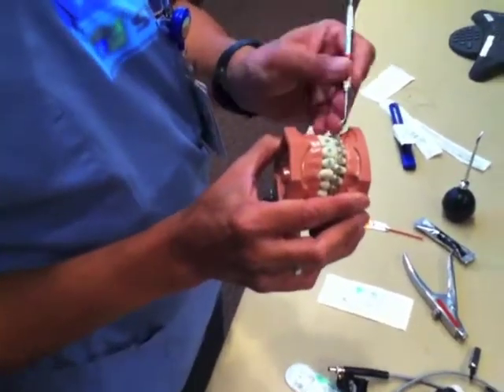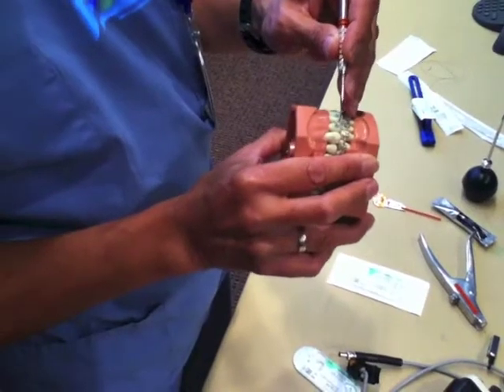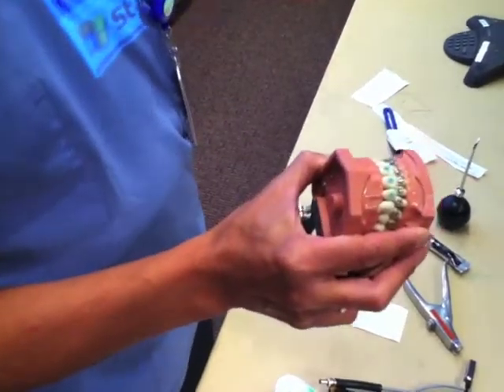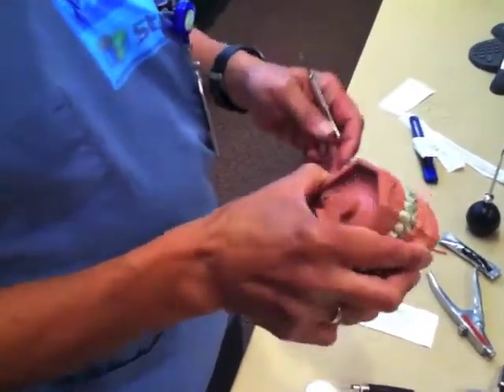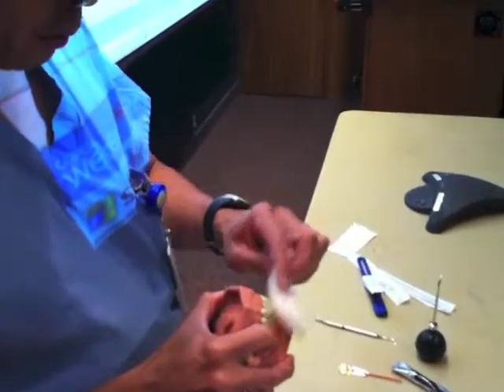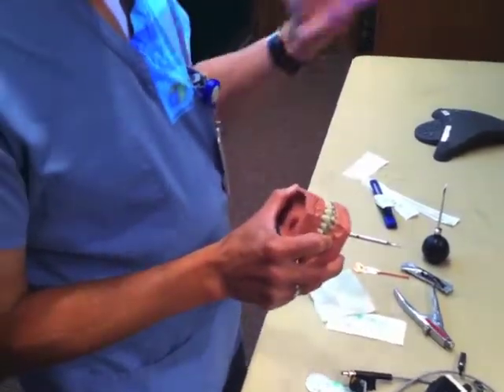You can take your plastic instrument — the round end — and push it around just to make a nice big circle on the tooth. It's not terribly critical that you're perfectly exact with this; you just want to make three blue spots. Then rinse this off with saline — rinse this material off. What it does is it actually etches the enamel so that this material will bond to it.